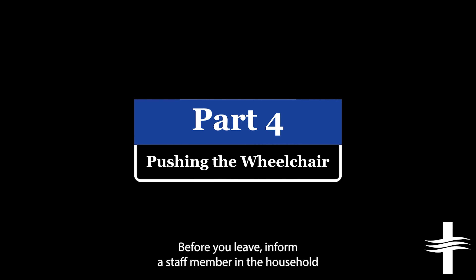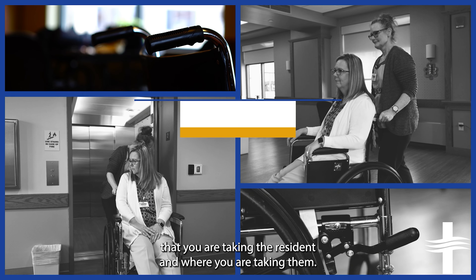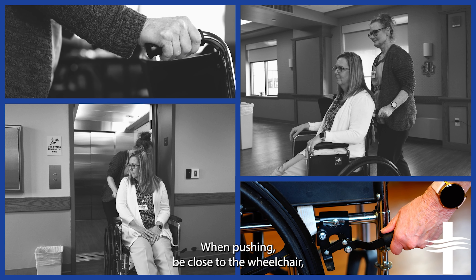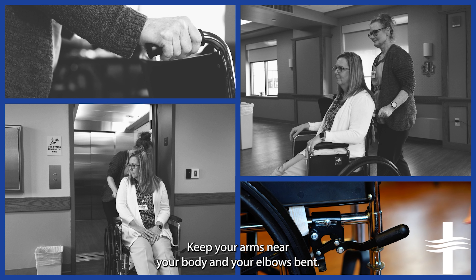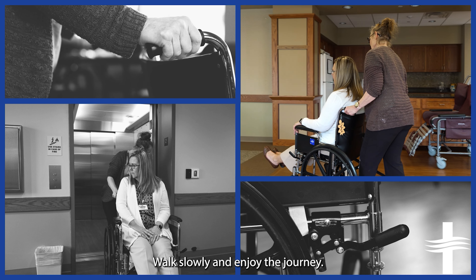Before you leave, inform a staff member in the household that you are taking the resident and where you are taking them. When pushing, be close to the wheelchair. Have a straight back and push with your whole body and leg muscles. Keep your arms near your body and your elbows bent.